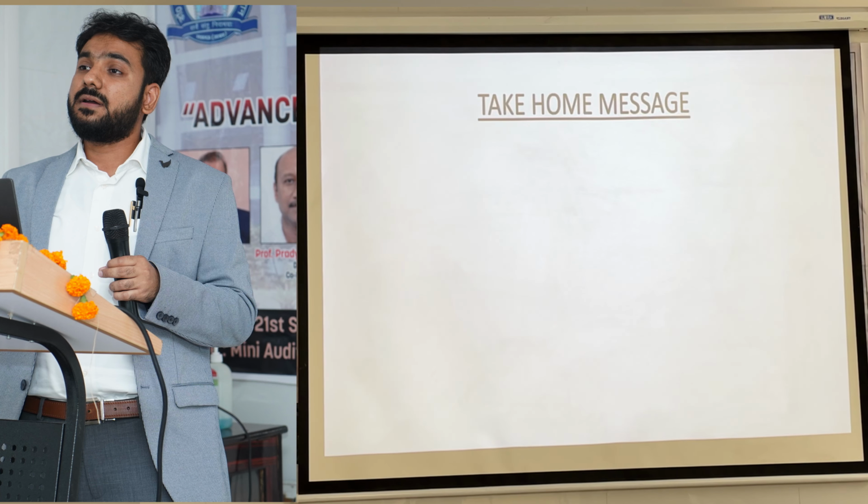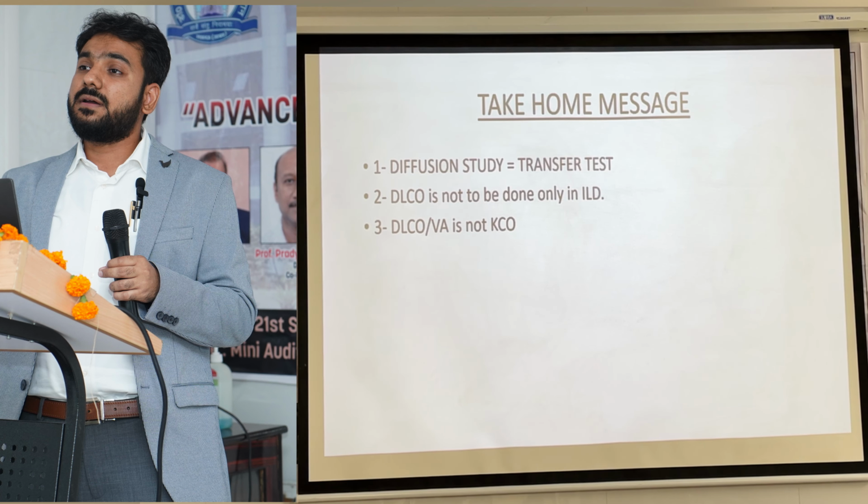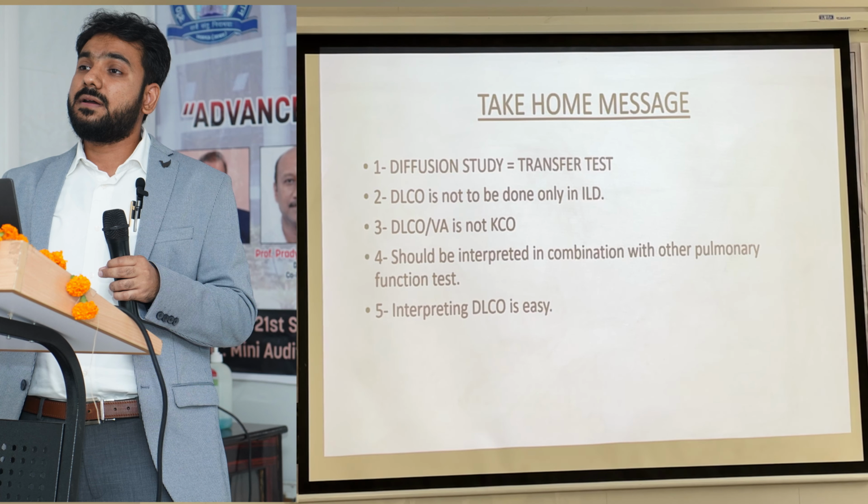Okay, so thank you, and I've taken more time. Just a quick take home message. The first is that diffusion study is a transfer test. It is not just telling us about the diffusion, but the whole process down to the hemoglobin. DLCO should not be done only in ILD patients. DLCO upon VA is not KCO. It should be interpreted in combination with other pulmonary function tests, and interpretation of DLCO is easy.